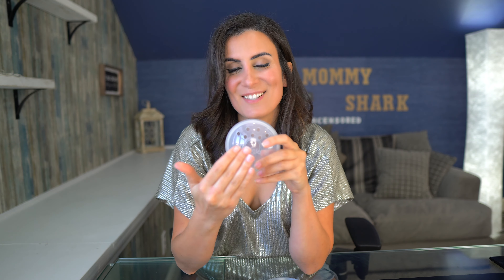The hole covers maybe half of the areola, and because of that, that really hard circular ridge on your really sore, tender nipples actually hurts. It actually hurt and I couldn't wait to take it off. These are good for that purpose if you need to be out in public and need to make sure nothing sticks on those wounded or cracked nipples. But if you create an anaerobic environment where there's no oxygen getting to your wounds, you will be encouraging yeast slash thrush to grow on your nipples — that's exactly what happened to me when I idiotically put plastic on my nipples and put my bra on.